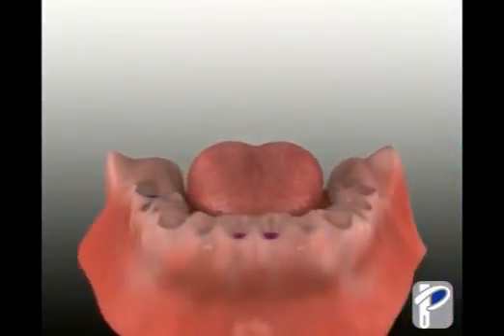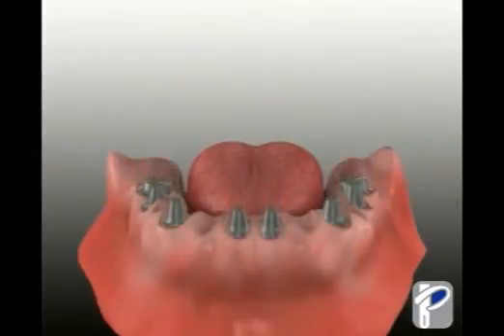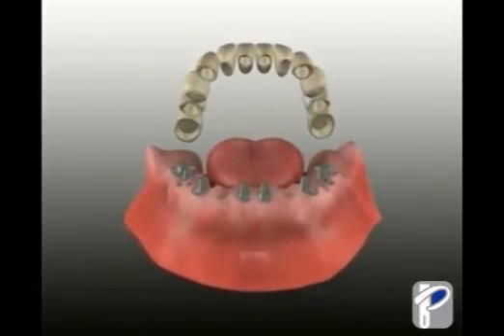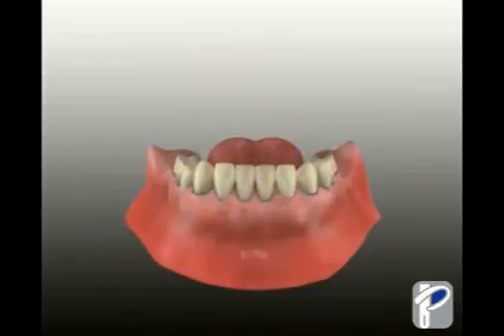This clip shows the loss of all bottom teeth, followed by the placement of Nobel BioCare implants. Abutments are then secured to the implants, and a Procera bridge is then used to replace the entire lower set of teeth, returning your functionality and your smile.